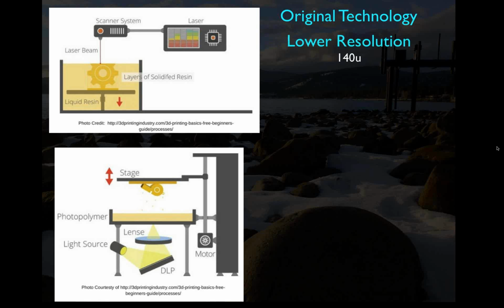Interestingly, it has lower resolution than DLP, which, when I first started looking into this, actually surprised me. The best unit on the market today is about 140 microns. We'll talk more about that later on and what the implications of that are, okay?